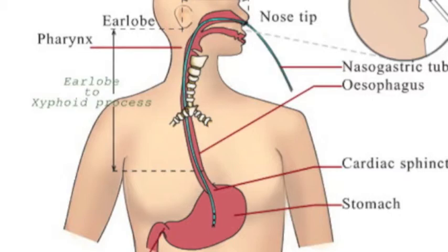Okay. And we're also going to be doing trach suctioning, nasopharynx suctioning, and also, not nasopharynx, but trach suctioning, excuse me. Okay. Trach suctioning and trach care.